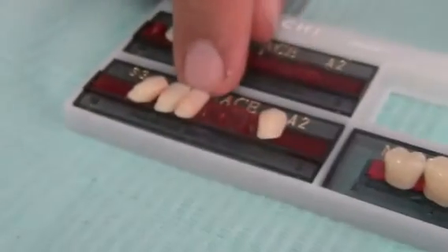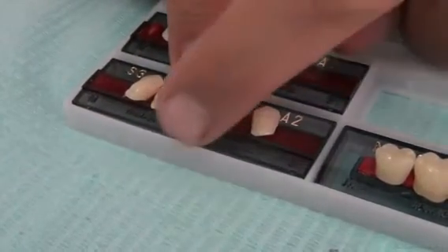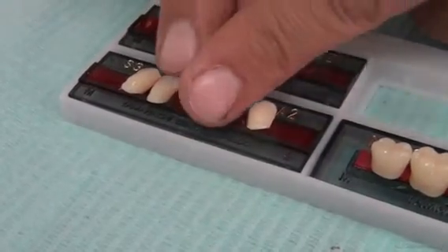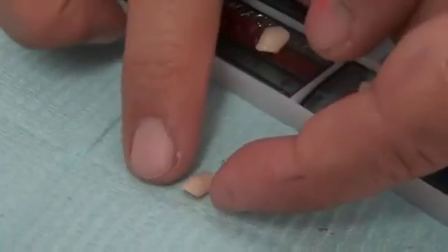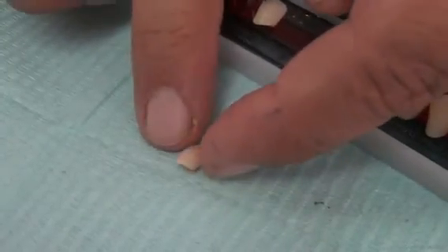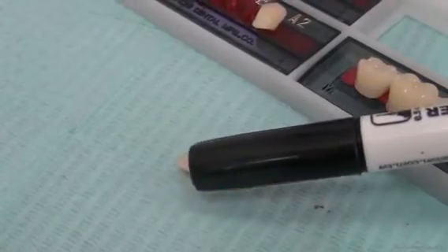It easily can be determined by the incisal position itself. If I want this incisal position straight, I could not get it if this tooth is tilted to the side. Okay, so if I'm going to put it here like this and observe the incisal edge, I would not get a straight incisal edge unless the tooth is angulated in this direction. You can see that the distal angulation of the tooth here is more.